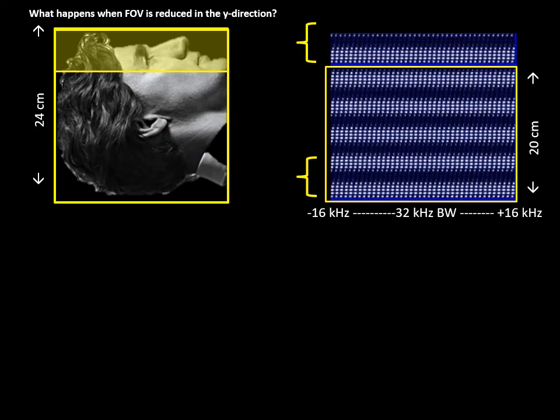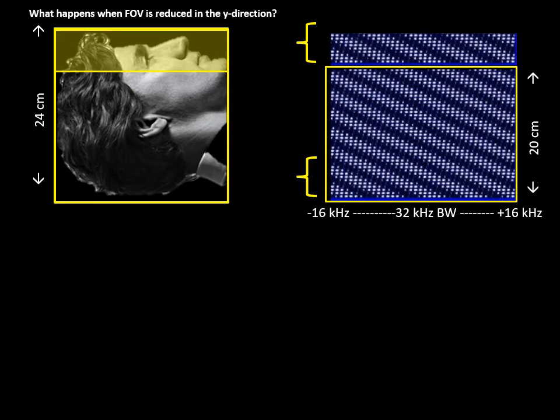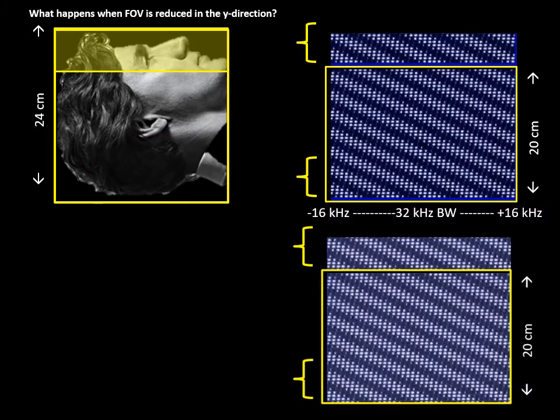We now take the spinning balls in their end pattern, take a screenshot and bring them down to the bottom right of the image and take a second look at what happens. There's the screenshot, and if you look at the pattern just beyond the upper margin of the field of view and that at the bottom of the field, they are exactly the same.